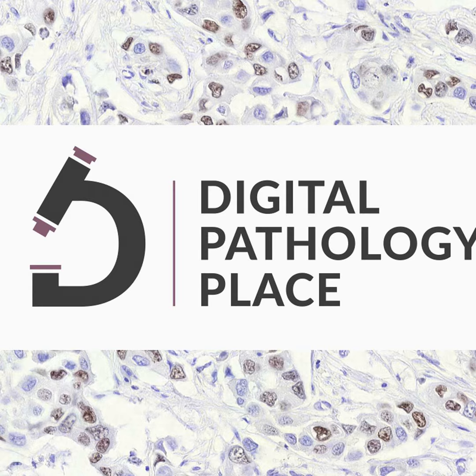So, large foundation models in histopathology. Foundation models are basically huge models, big models that can do a lot instead of just a very specific one that detects glomeruli, right? So we have these foundation models for histopathology, and they have demonstrated significant potential in advancing computational pathology very much. Now, basically you can potentially remove the bottleneck of annotations or reduce it so much.